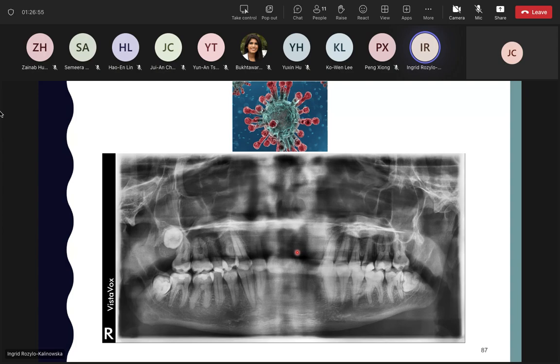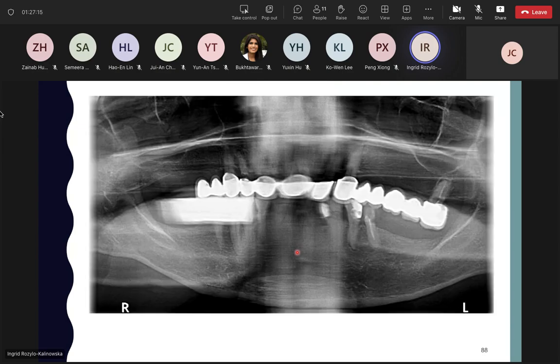on a trolley for panoramic radiography, but he was not able to stand in the machine. He could just sit a little bit, but we were not able to get a good panoramic radiograph in such conditions. So we just supplemented the radiograph with some periapicals. And this is a mistake of one of our trainees in radiography.